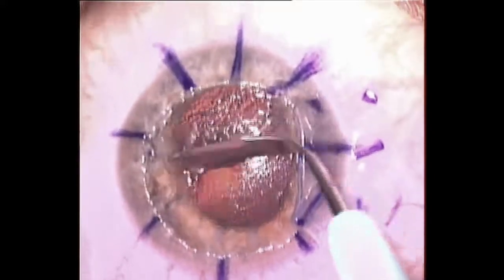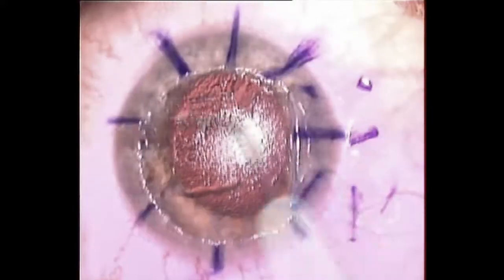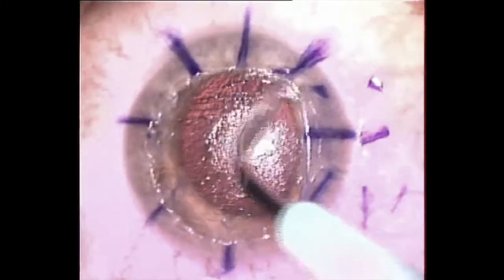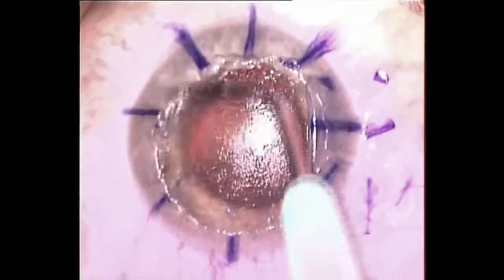Once the flap is relevated with a lot of care, then with a crescent knife we are cleaning the surface by simply taking away the material that you see in the interface. You see here how this material, which is composed of cells and mucin, is being eliminated, carefully done both on the stromal side and later on, as you will see, on the flap stromal side as well. The scratching that we perform with a crescent knife is extensive but not traumatic. We don't want to create any type of scarring in the interface, but it has to be strong and vigorous in order to eliminate this foreign material.